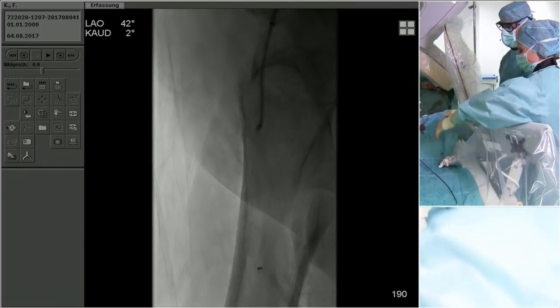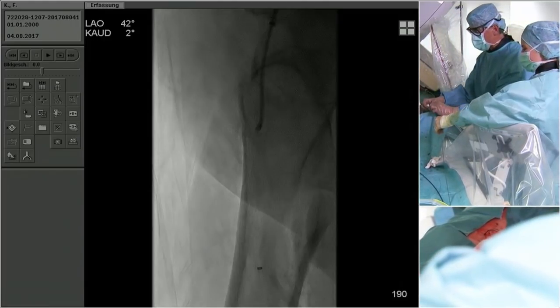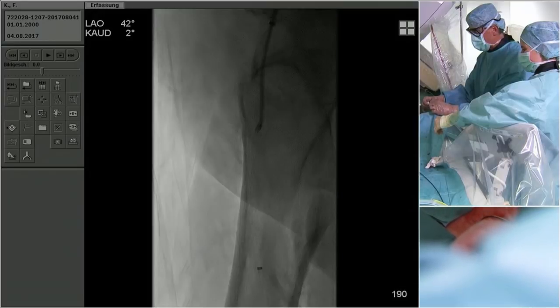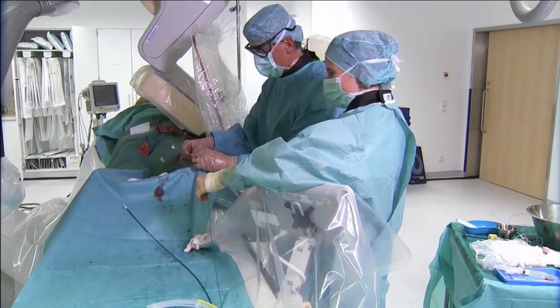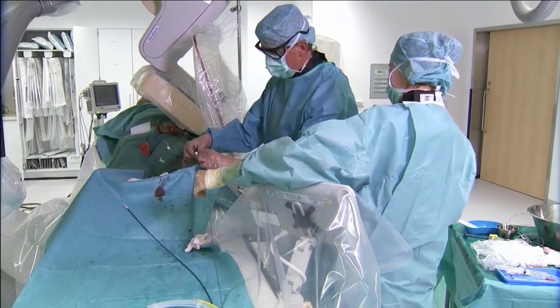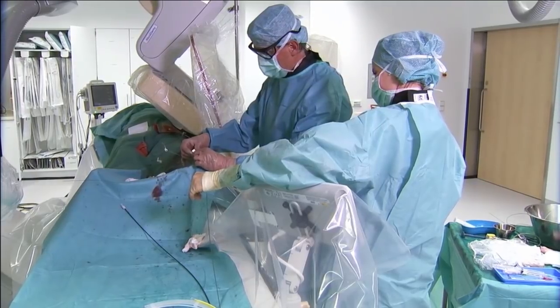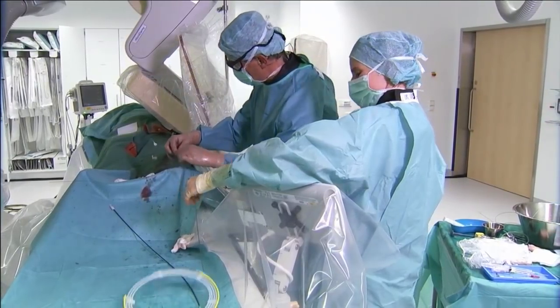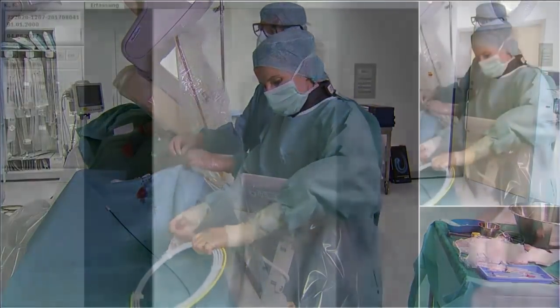Well, they mentioned that they used the patch and took the patch from the common femoral to the profunda. Correct. So that's a point I wanted to make surgically, which is that bulbous proximal profunda may very well represent the patch into the origin of the profunda, and the actual proper common femoral is above, which is just semantics because you're going to re-enter there anyway.